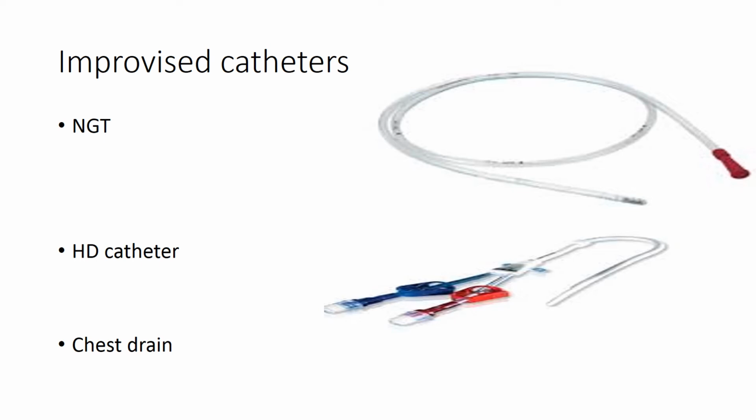For very small kids, infants, preemies, one would use a size 14 nasogastric tube. For bigger kids, I actually find that the size 18 nasogastric tube allows us to add an adapter much easier. I'll show you what I mean on the next slide.